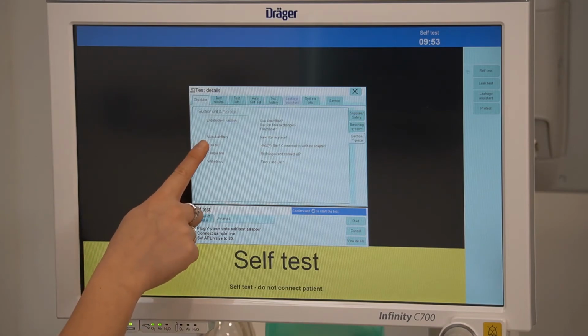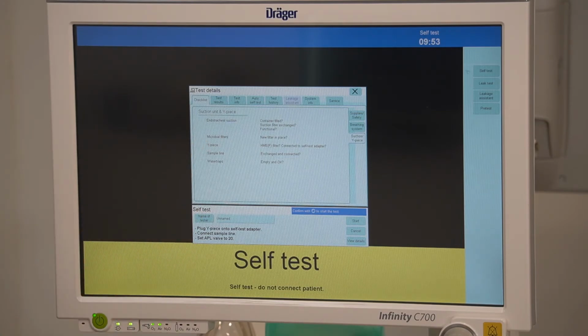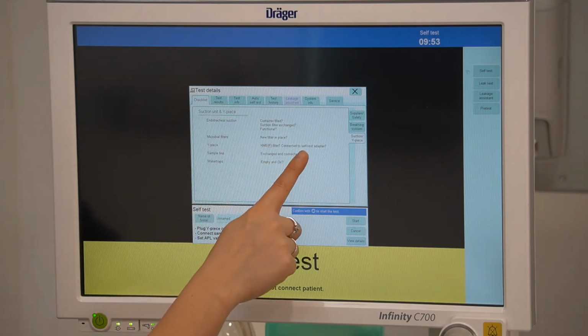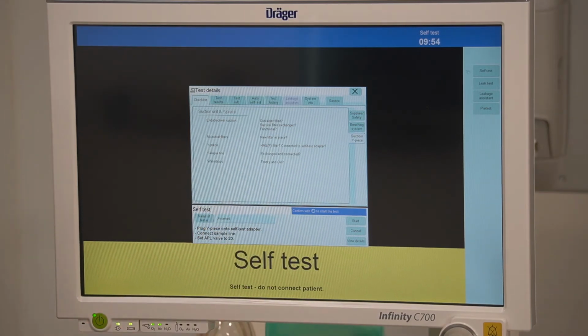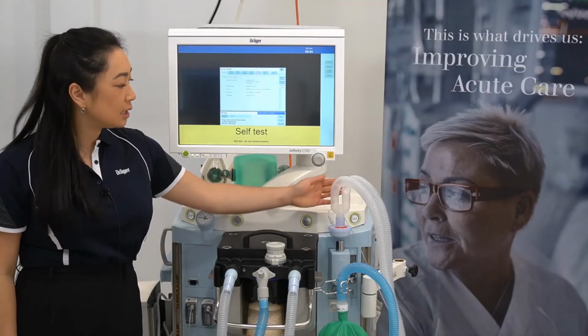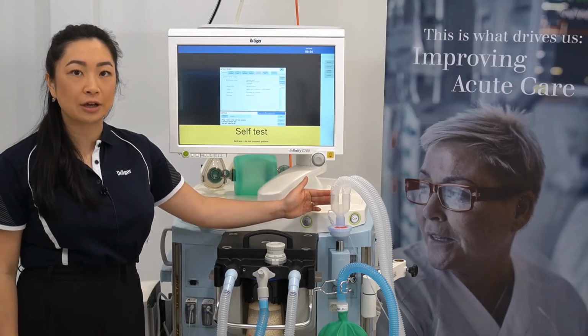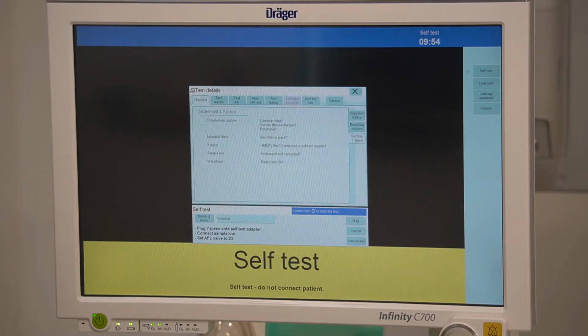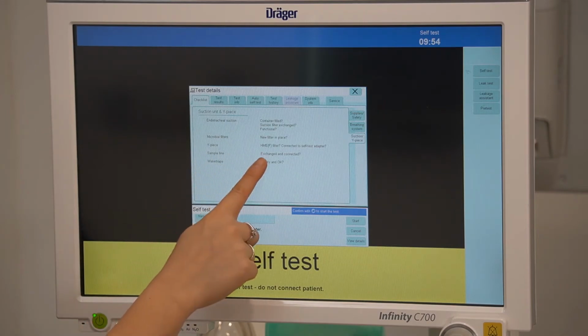To check the oxygen emergency delivery system, set the safety flow to 12 litres and ensure the bag fills. This is verified by opening up your safety oxygen control knob by pushing in, dialing up to 12 litres with the flow indicated on the outside of the knob, and observing for the filling of the breathing bag. Then return the safety control knob to its original position.